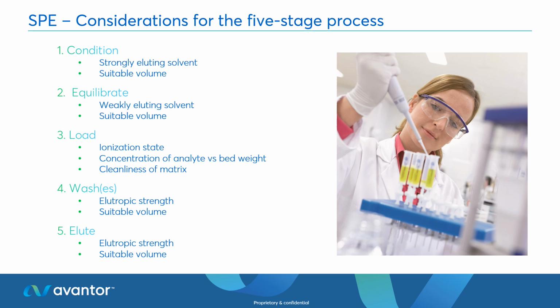So when we're looking at those 5 different steps, there are several considerations. The conditioning step, as I mentioned previously, needs really to be a strongly eluting solvent. The rationale for that is that it disrupts the type of bonds that are occurring, but it also gives you the best interaction with the surface of the stationary phase.